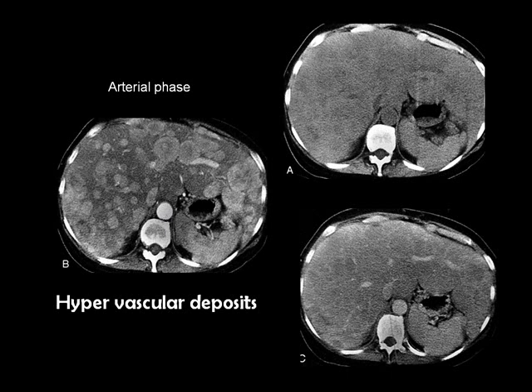And you all know that the liver masses are supplied by the hepatic artery, and the normal liver parenchyma is supplied by the portal vein. Then in order to see the hepatic pathology, you should scan the liver while the contrast is in the artery. This is what we call the arterial phase. Then you may scan the liver later on while the contrast is in the artery and vein as well. This is known as the venous phase. And later on you scan the liver 2 or 3 minutes later, and this is the delayed phase.